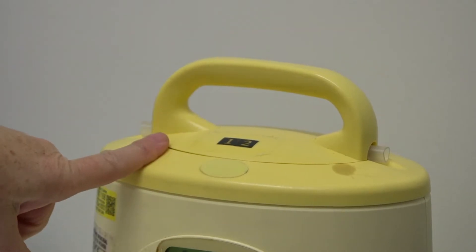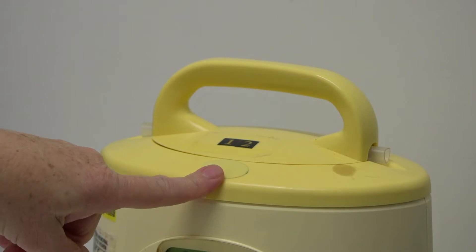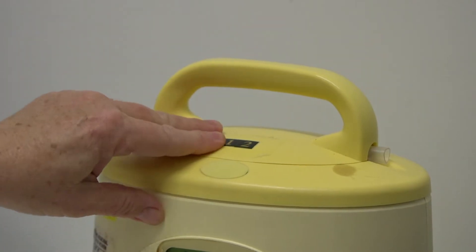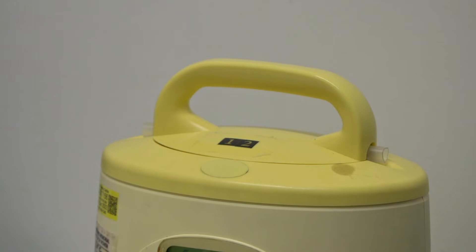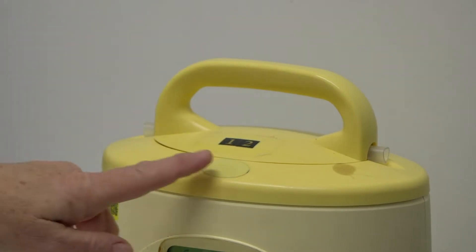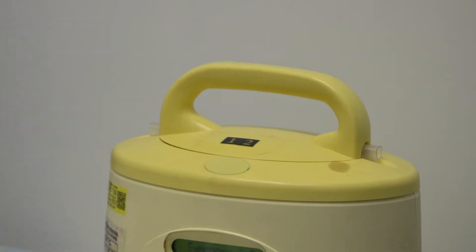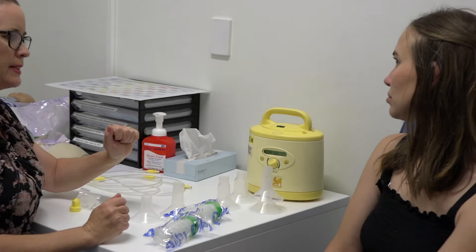Those caps and membranes can be accessed if you need to by just pressing this oval button on the top. Once they're in there you probably won't really need to do anything with them, but if you notice that the lid is lifting, you can turn the pump off, press that button, lift the lid up, pop them in a little bit more firmly, and close the lid.